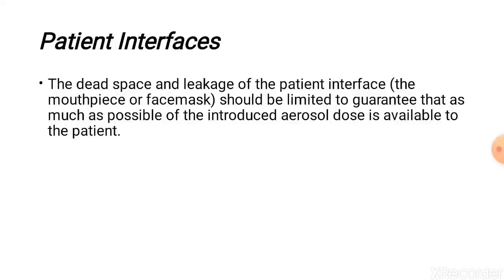Patient interface: you'd better use an interface that doesn't leak at all. Choose carefully, or when you put the patient on the ventilator, check for leakage if there is any.